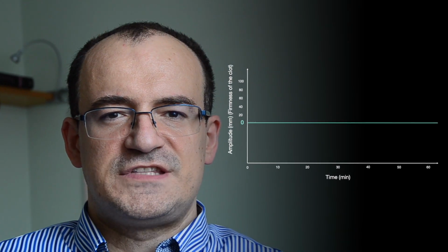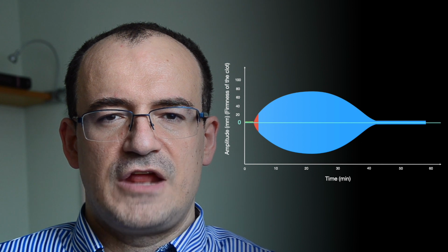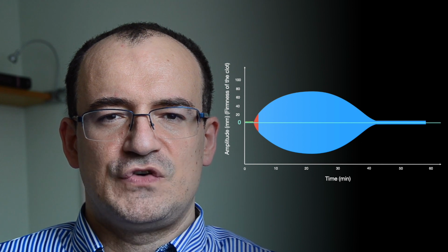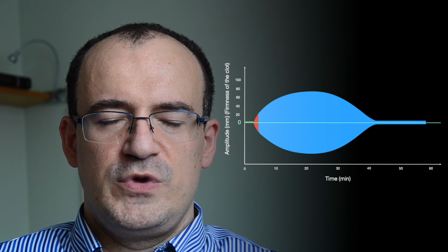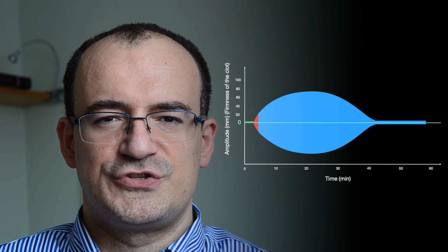At the end of the investigation, the graphical record has a typical and characteristic curve, which reminds one of the silhouette of a swordfish, on which we can recognize elements such as the sword, head, torso, and tail.